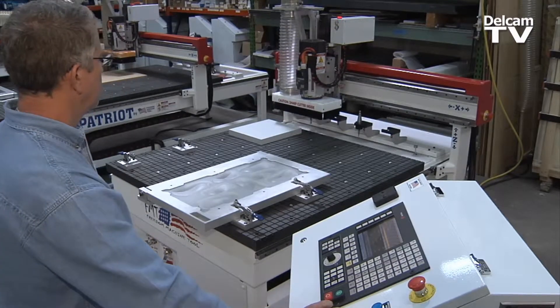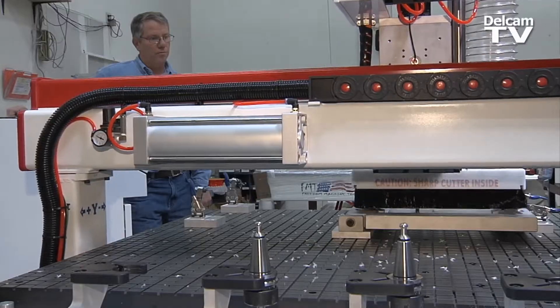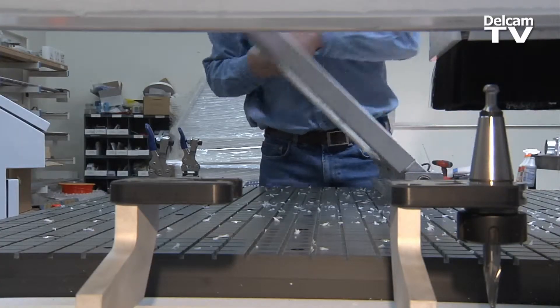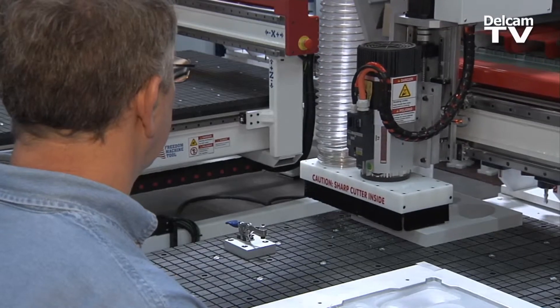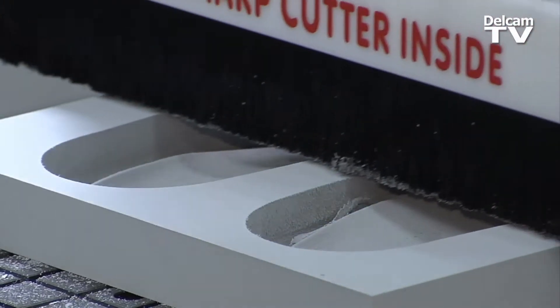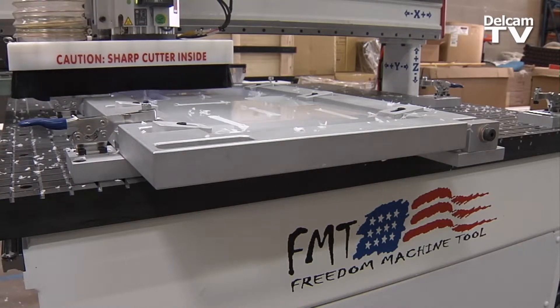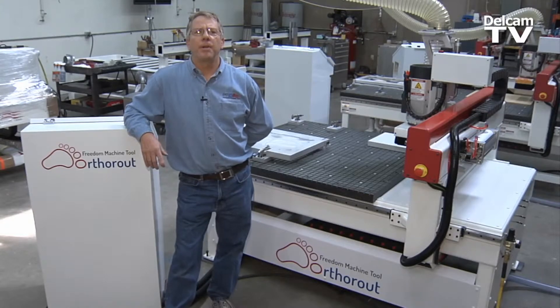The OrthoRoute is a machine we designed for the orthotic industry. It's on a 4x4 frame. It is a 5 station tool rack with an auto tool height setter. We also have a flip fixture for your hard polypropylene orthotics and we have a vacuum zone table which will allow you to cut your EVA foam and also allow you to cut molds out of your medium density or low density MDF material for forming your hard orthotics.